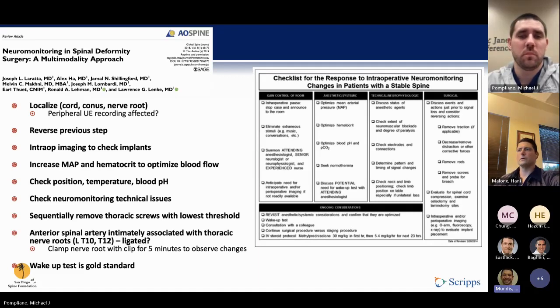And I've had 3 of those in my 15-year career. So that's, in my opinion, 3 saves. Those are cases where we ended up not ligating the nerve root, and we did whatever we could apart from that. So yeah, I didn't make that connection, the difference of MEPs and SSEPs in that context, but that does make sense. Thank you for bringing that up.